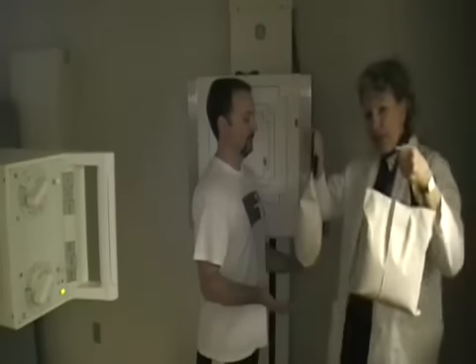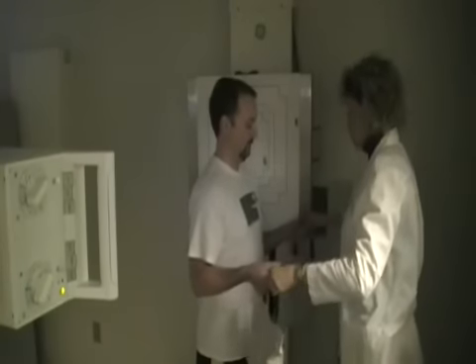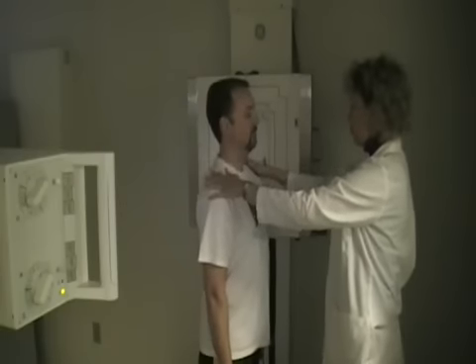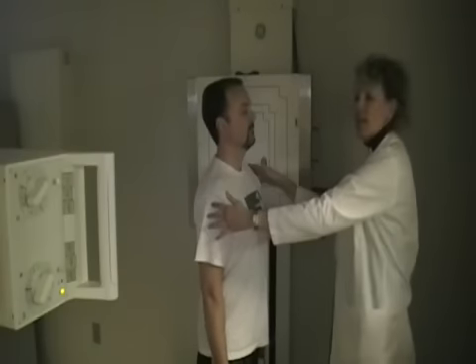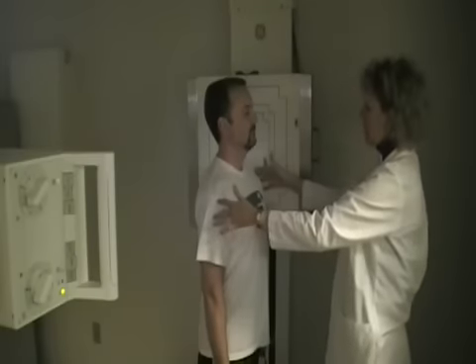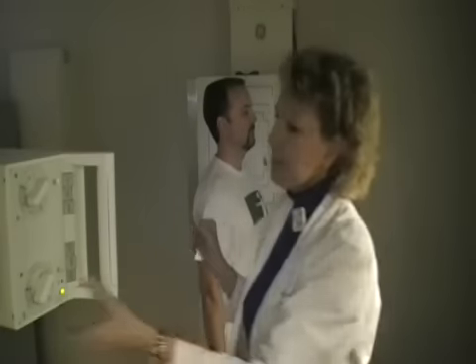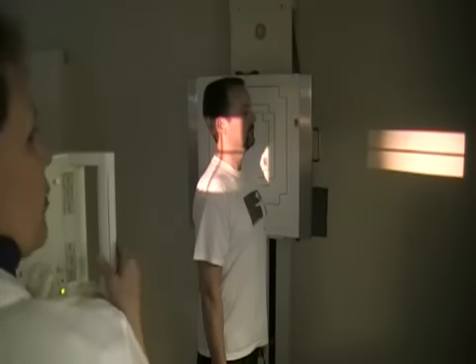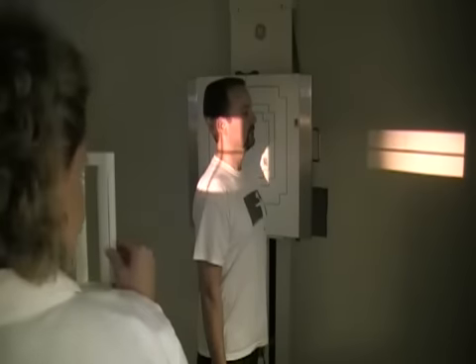Now I'm going to give David some weights here to hold, and put your arms down by your side, and that should pull the shoulders down even more so that we can see hopefully all 7 of the cervical vertebrae and the top of T1. So that is our lateral cervical spine.